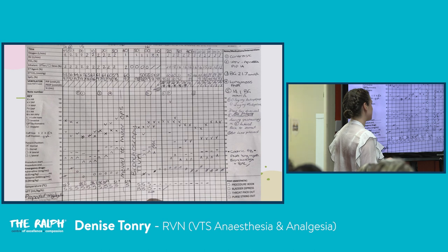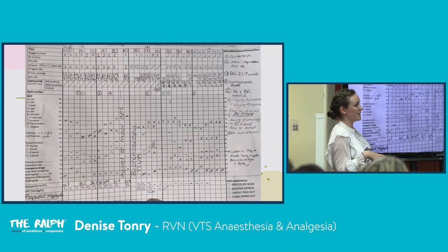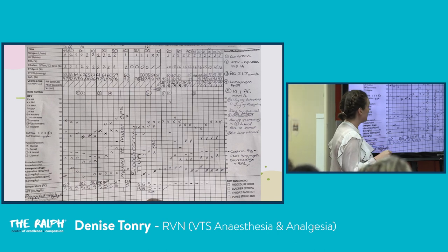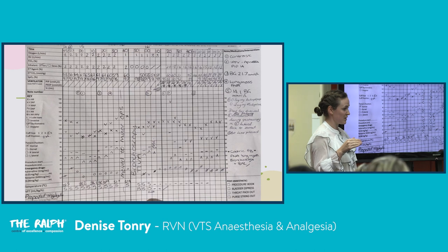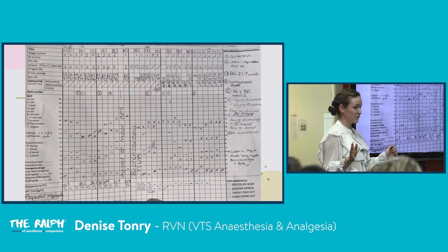I don't have any volumetric measuring, so I don't know. But I can assess from her pathology and what we saw on the CT: this patient had a lung mass taking up quite a lot of the right lung. So there's no way this patient is managing to use her total tidal volume. In hindsight, with this kind of lung mass, I do not need to provide 200 mils to this 20 kilo animal. She does not have that lung volume. It's taken up by some sort of growth.